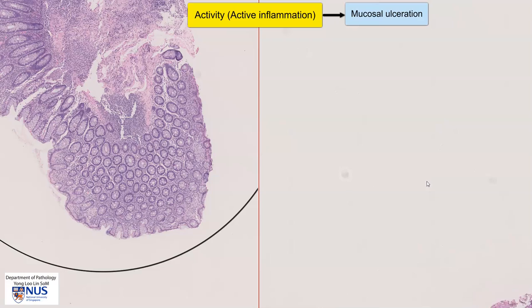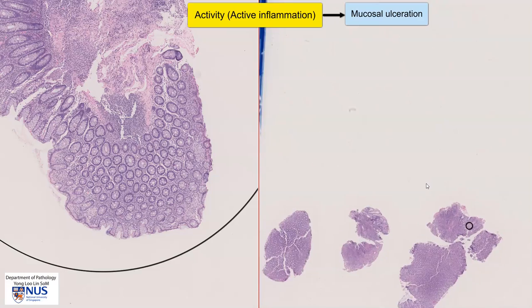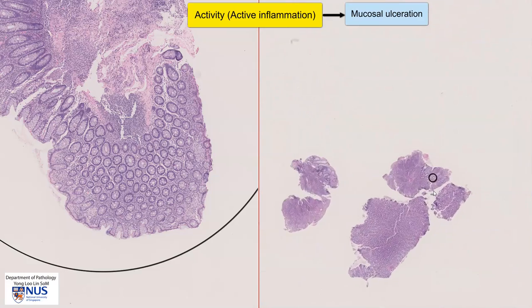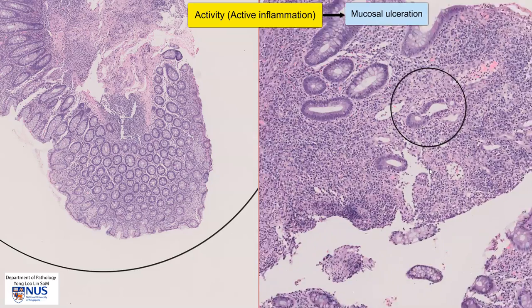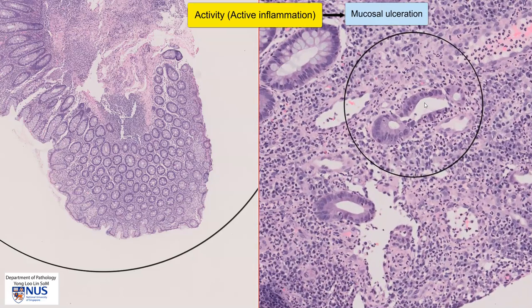Another feature of active inflammation can be seen in this biopsy here. If we look at the crypt, we can see that there are a lot of neutrophils infiltrating into the crypt epithelium, and this is known as cryptitis. This is also a sign of activity. Sometimes we can have aggregates of neutrophils within the lumina of the crypts, and those are known as crypt abscesses.